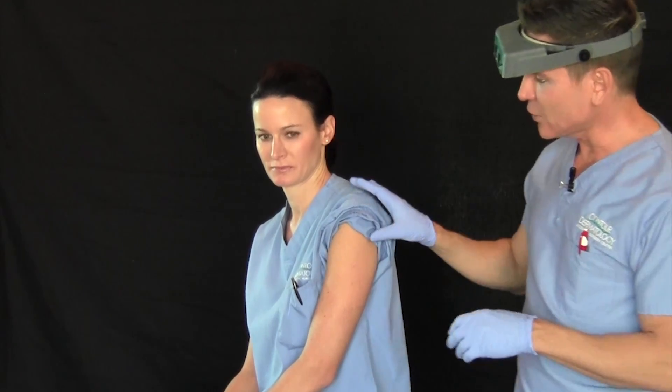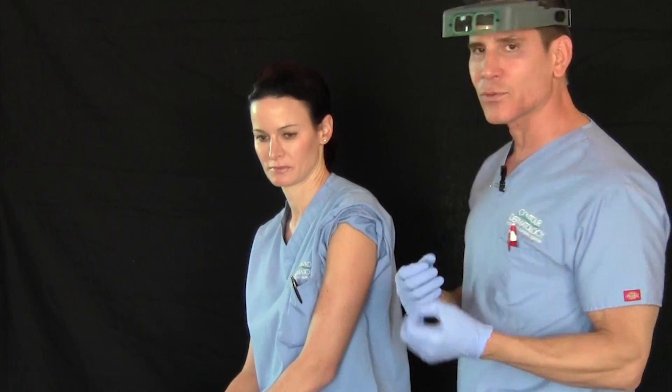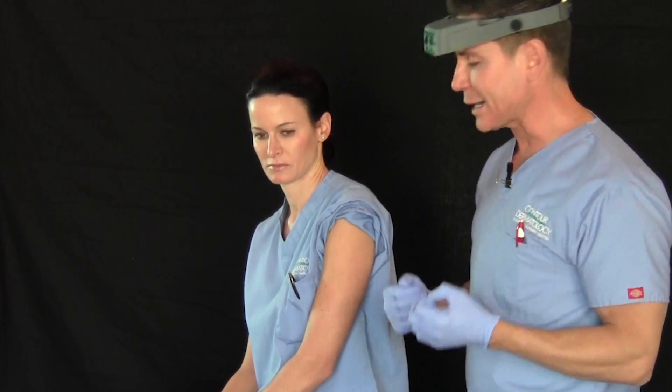Hi, I'm Dr. Tim Joshin. Today we're going to demonstrate a punch biopsy. Oftentimes if we have a skin rash where we think that the rash is deep in the tissue, or if we have a mole where we want to get all of the cells, we do a punch biopsy.